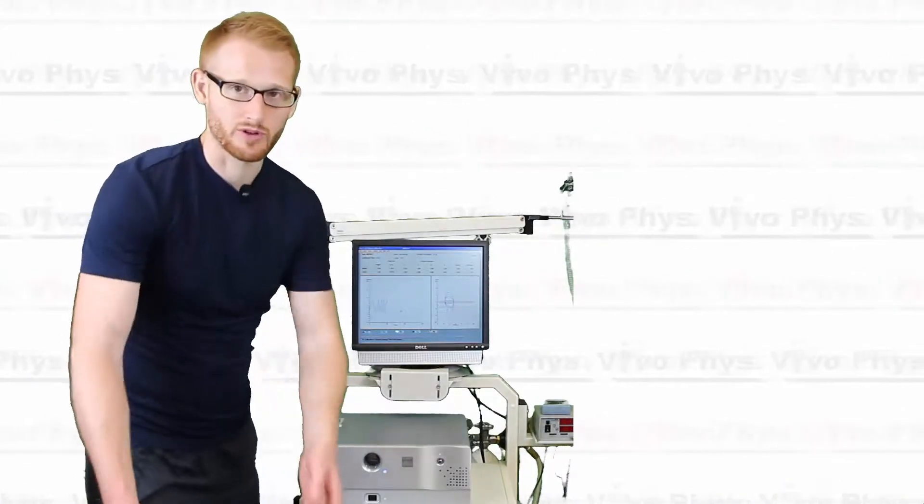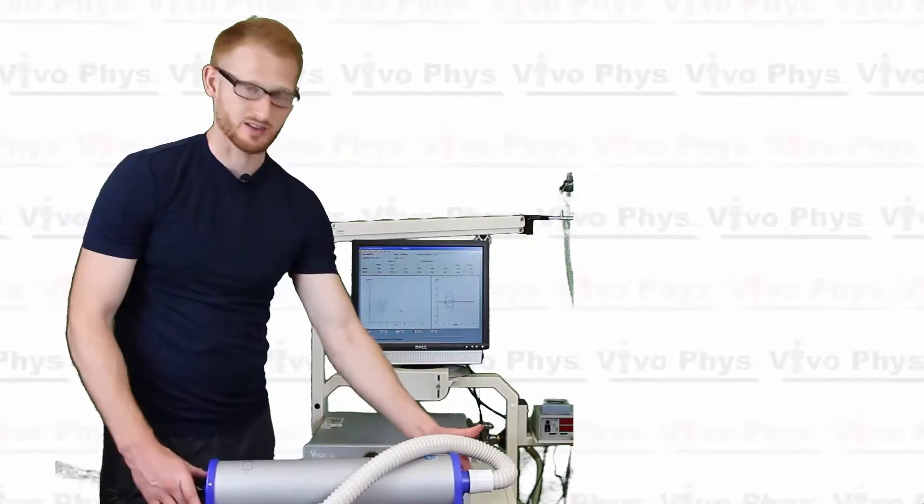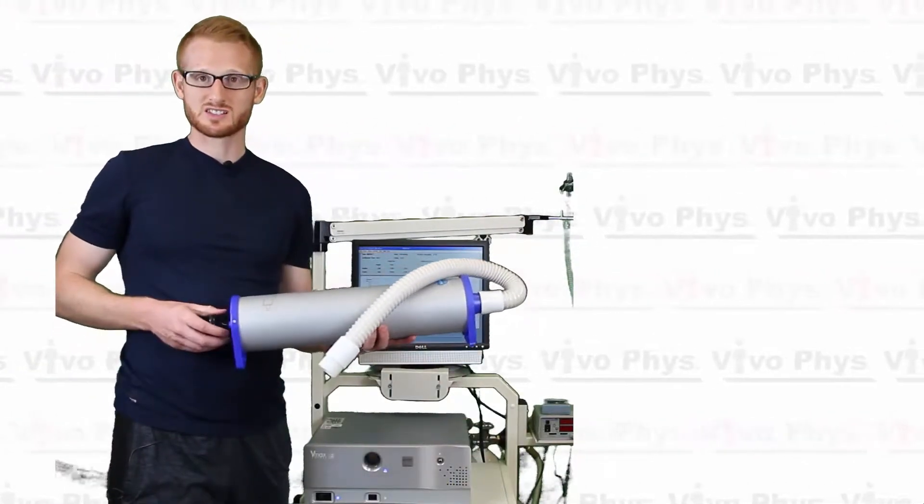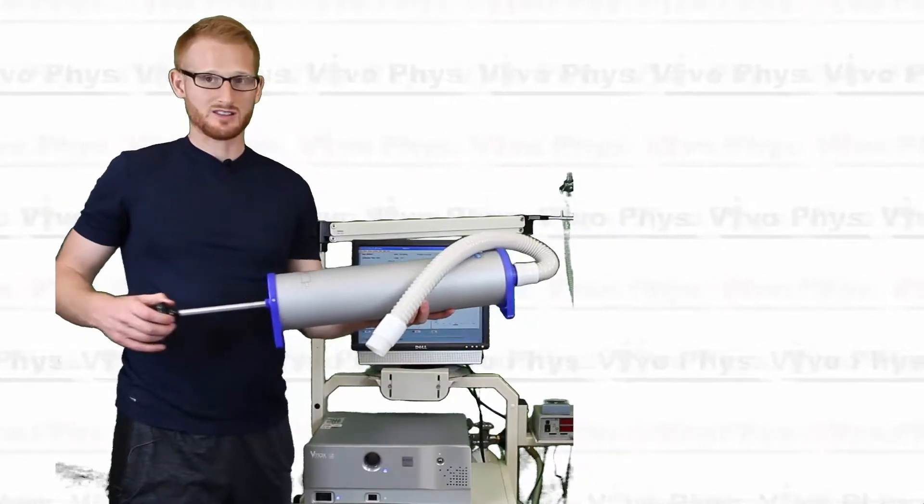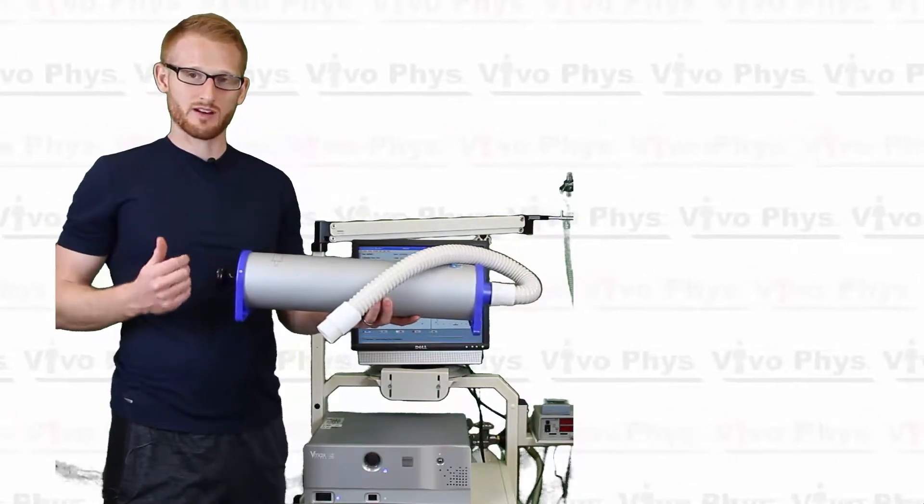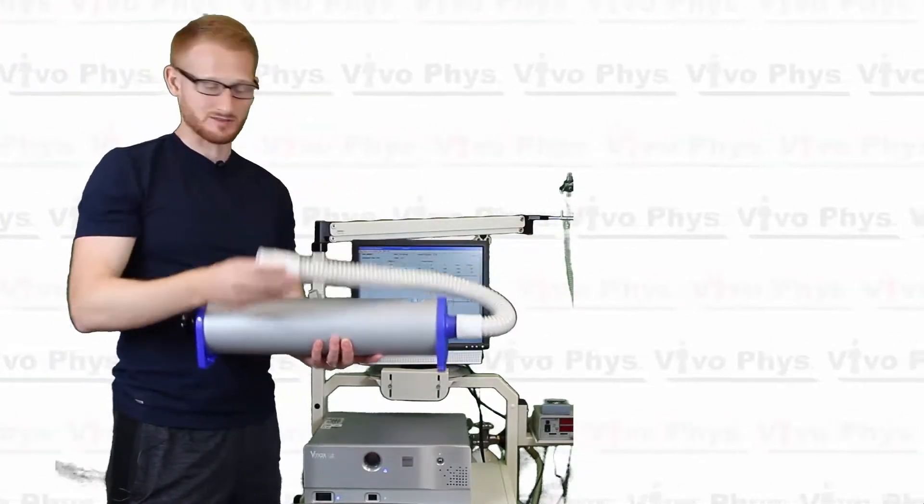Alright, in order to do a flow calibration, you need a standardized syringe, something like this here. So this is a 3 liter syringe, most of these systems are going to come with one. It's literally a giant syringe, here's the plunger. So it's going to take in 3 liters of air and pump that 3 liters of air through this tube and into the system.